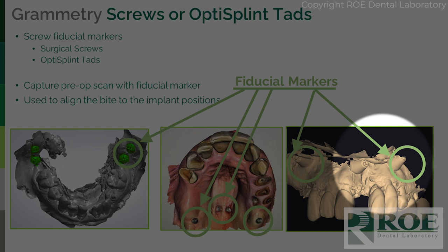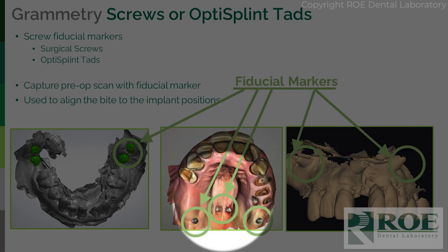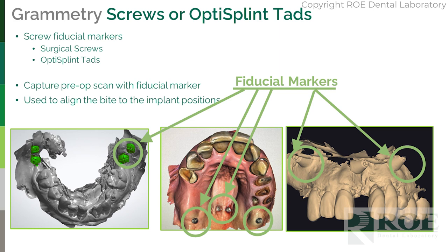But the key here is that this is the beginning of surgery. You know, in this case, it's flapped over here on the right, the arch tracers. You have to flap first to set these. Screws, you just place them here in the retromolar pads, or you place them back in the palate, or just beyond where the suturing is going to be, where the flap is going to be, or down in the palate. And those screws remain in the mouth during the entire surgery. That is key to saving the bite. All right, this is prior to digital impressions being captured with the bite.